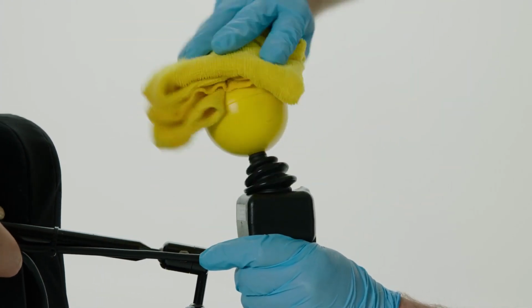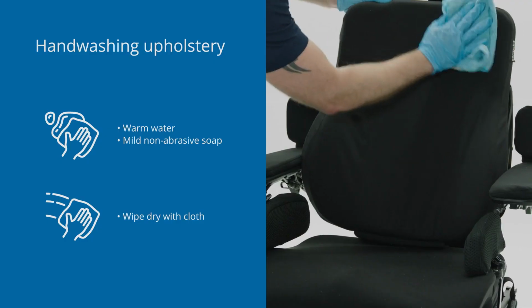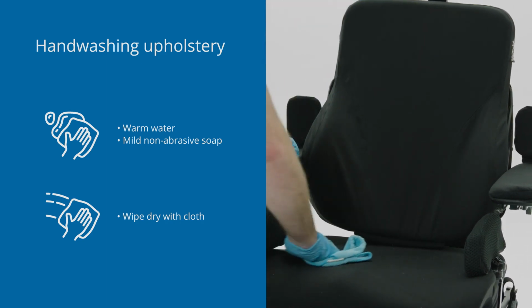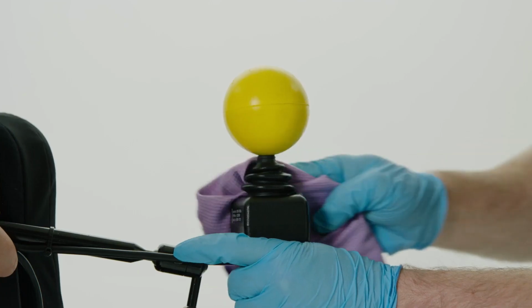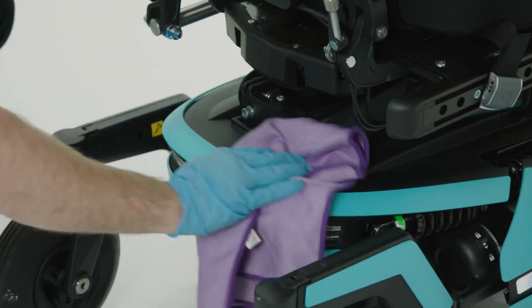Make sure to take special care not to get water or other liquids in the control panel or various electronic components of your chair. For any cloth or vinyl upholstery on your chair, wash with warm water and mild, non-abrasive soap with a soft cloth or brush. Before the surfaces dry, wipe off any water or cleaning residue with a clean, dry cloth. If necessary, upholstery covers may be removed and washed according to the label instructions.